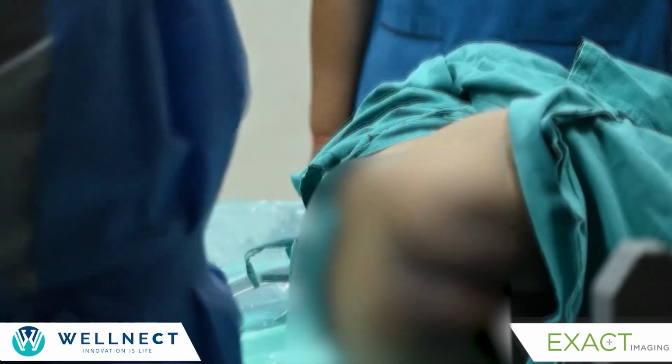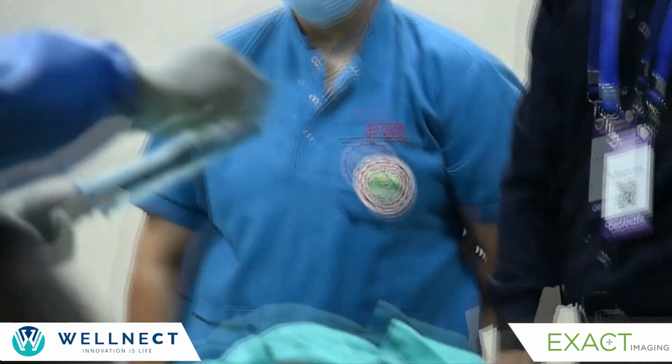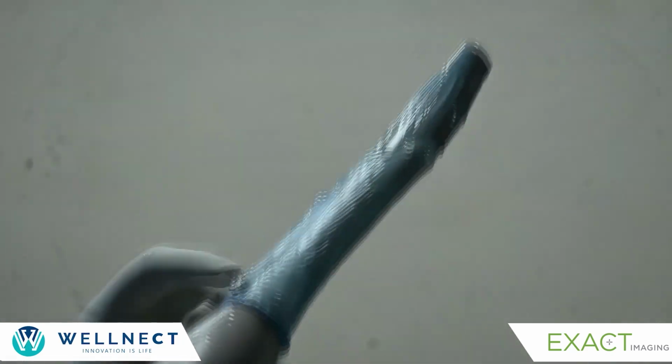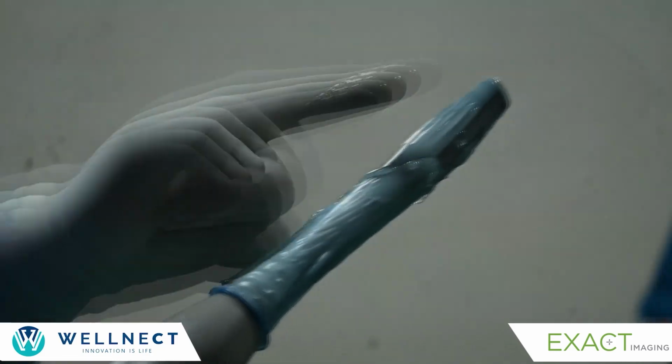Now once this is done, this is the probe that you see. First you have to put some lignocaine or ultrasound jelly on the tip of the probe. This is the biopsy attachment which is provided by the company, and this is a side firing.